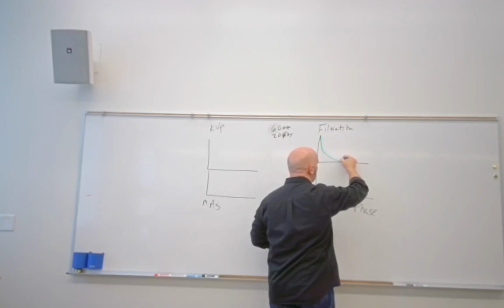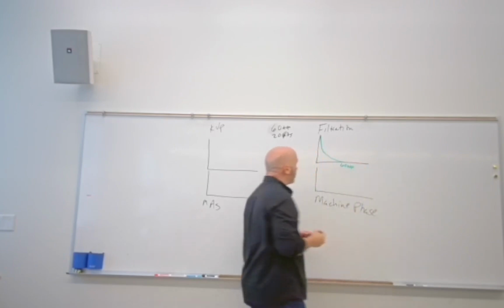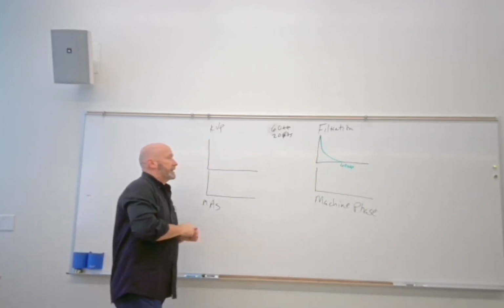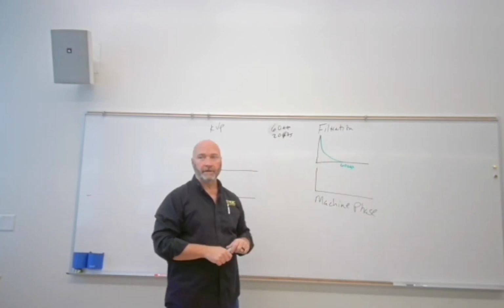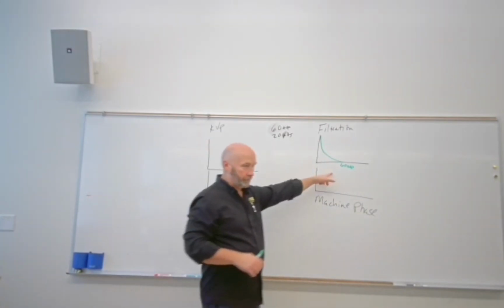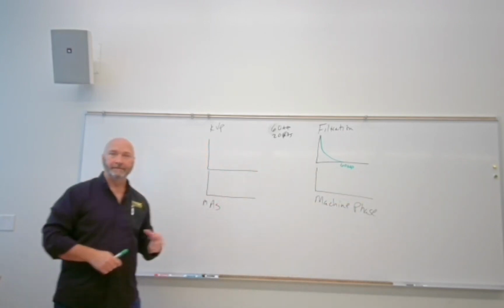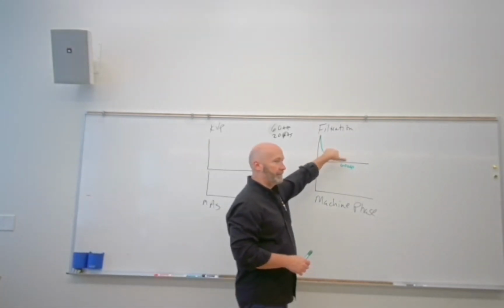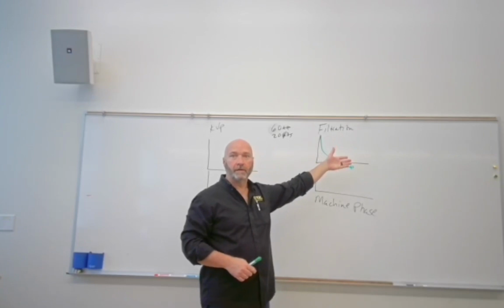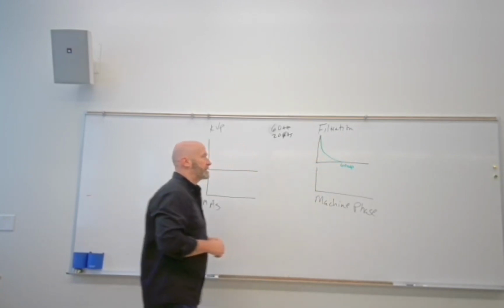At 60 kVp, what you get is an X-ray beam that is comprised mainly of low energy X-ray photons. Very few of your peak energies. So it looks like that, but that's not the beam that you use, right? That's just what it looks like coming off of your anode. A lot of low energy X-ray photons.